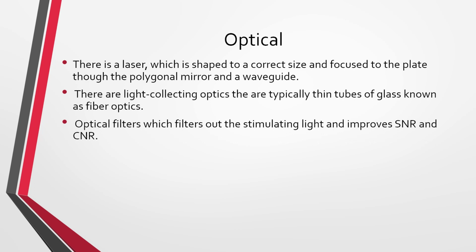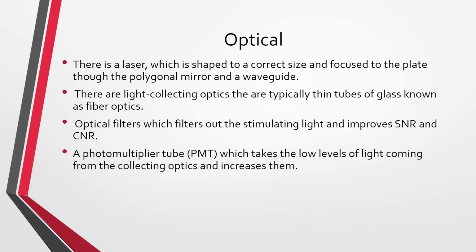Optical filters, which filter out the stimulating light and improve signal to noise ratio and contrast to noise ratio. So the stimulating light and the emitted light, even though they're very far apart, as we talked about, there's still a filter in place to even make this process better.